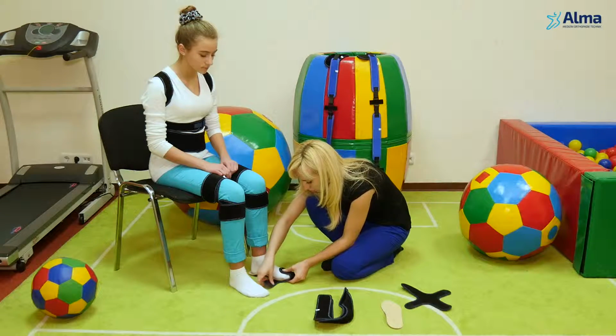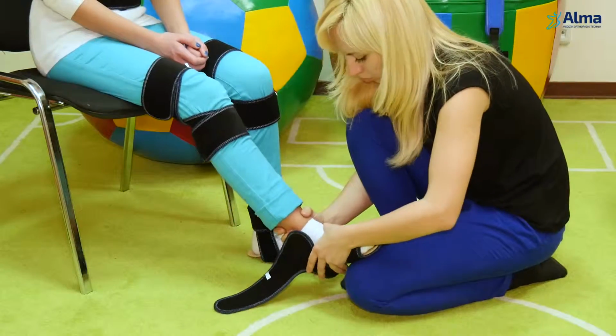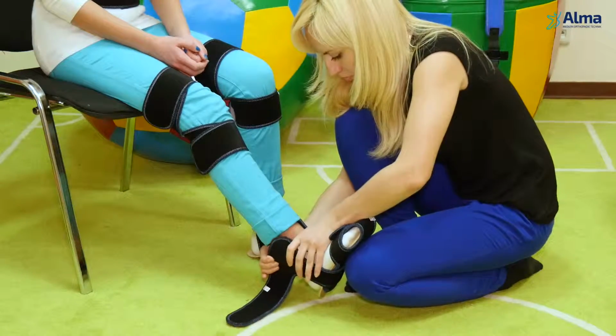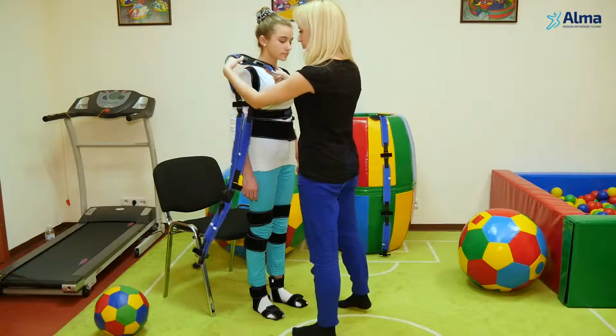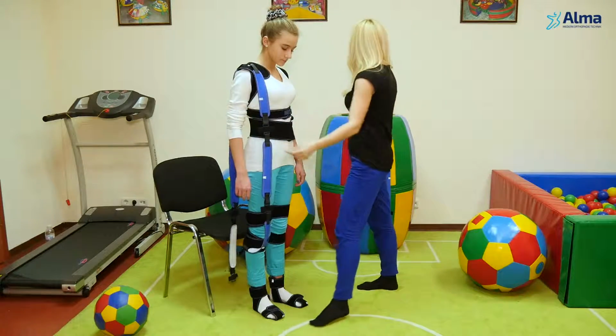Calf bandage is the only device element which has left and right version. It is fastened to the toe and sole element. While fixing on a foot, fastener of the calf bandage shall be on the side of the element and have front area closing. When all basic mounting elements are fixed, load chains can be fastened.